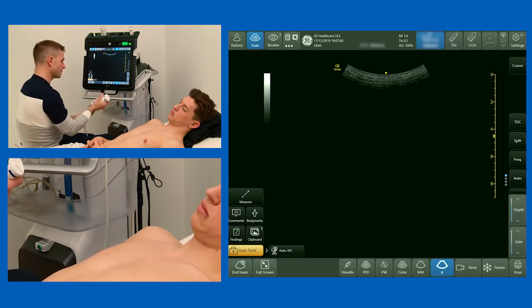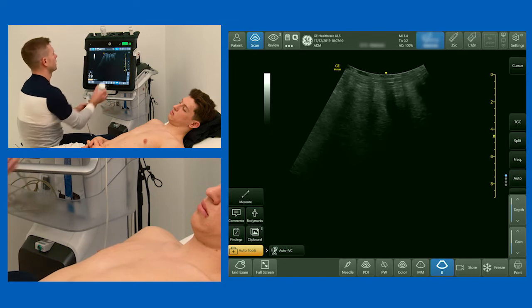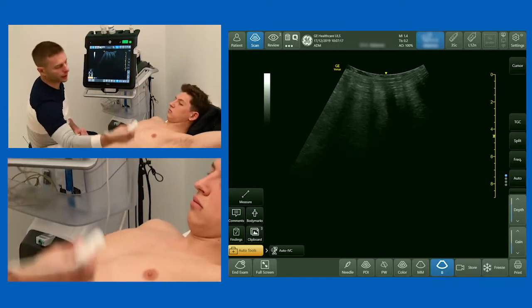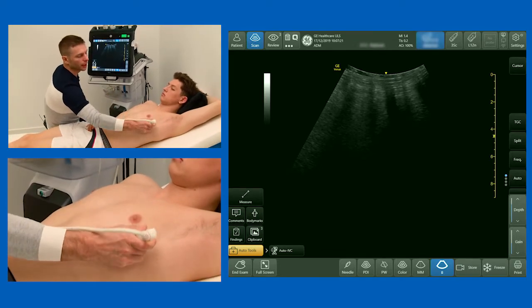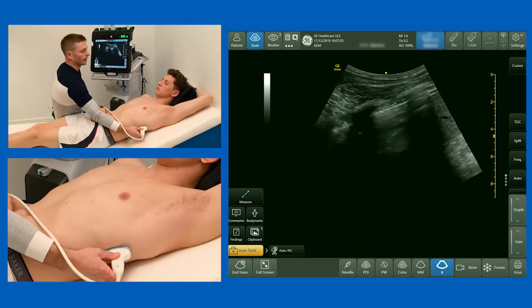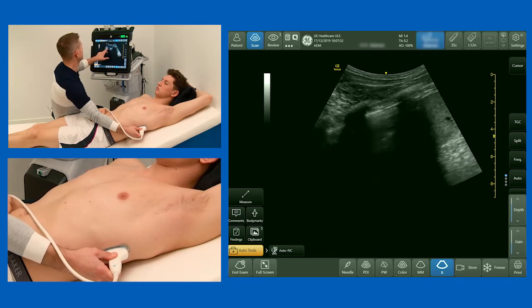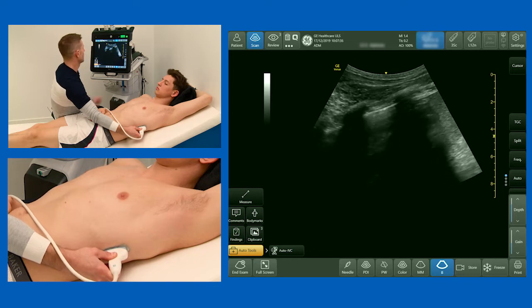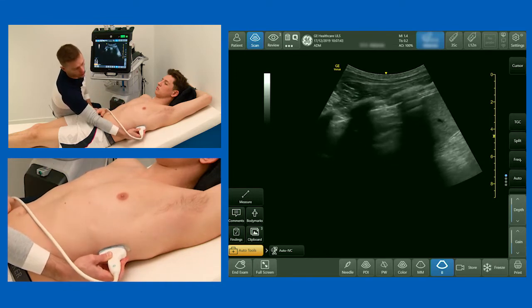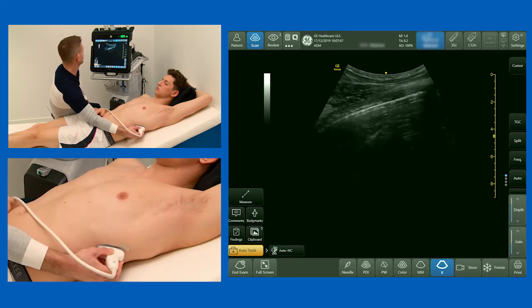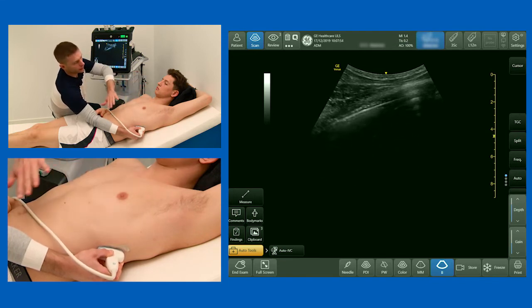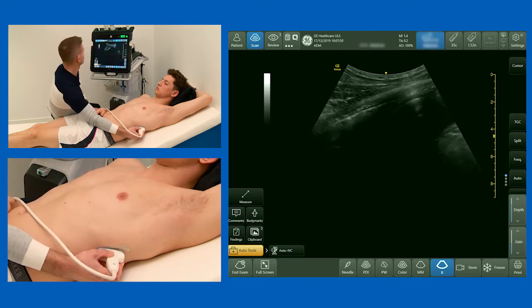Finally, we move to our third examination point. From the lower anterior point, go laterally and posteriorly as far as you can, a couple of rib spaces down, and place your probe on the chest. You'll see rib shadows in the way, but because the ribs run diagonally, you can rotate the probe slightly to get in between them and those rib shadows disappear. The probe is mostly still cephalad-caudad — just rotated enough to get the rib shadows out of the way.